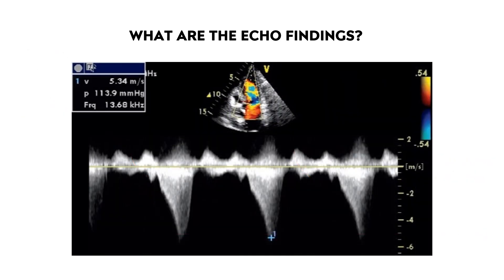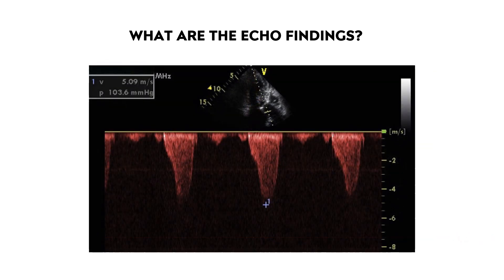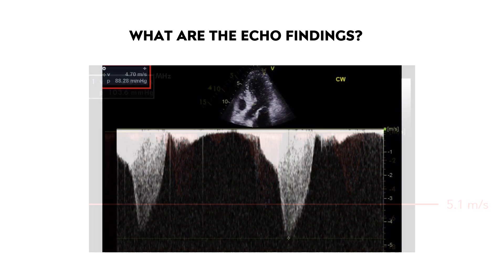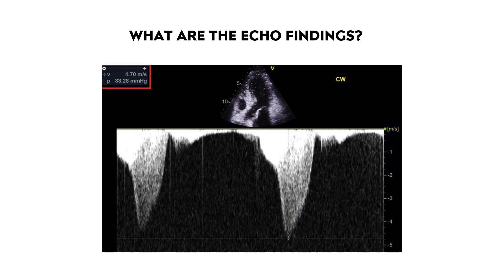Here are additional examples of LVOTO. The first shows a dagger-shaped appearance with a peak velocity of 5.3 meters per second — a severe obstruction. Another example again shows the dagger-shaped Doppler tracing with a peak velocity of 5.1 meters per second. The last example has a dagger-shaped appearance with a peak velocity of 4.7 meters per second — again, a severe obstruction.